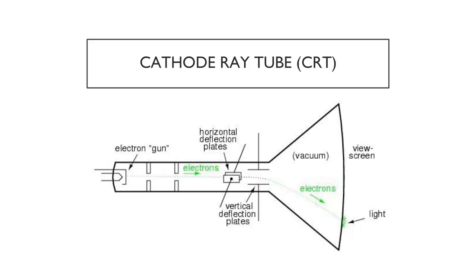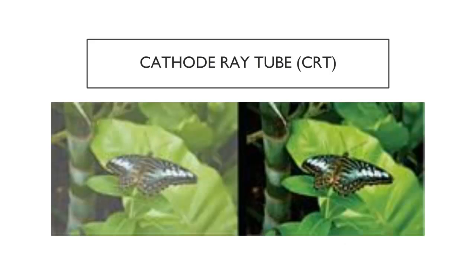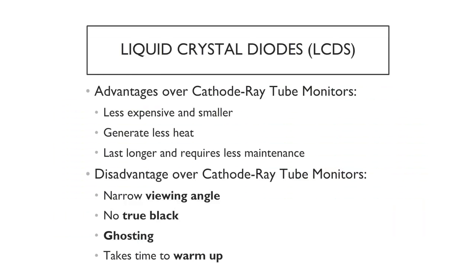The sharpness and brightness can vary or be uneven as well. Another issue with CRTs is veiling glare, which is mostly light scatter from the output screen and causes a decrease in contrast as seen in this photographic image. Another disadvantage is that CRTs generally do not last as long because of deterioration of the brightness of the image display. So let's compare that information with the more commonly used display monitor in medical imaging.